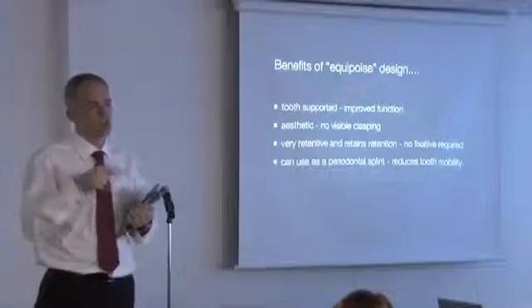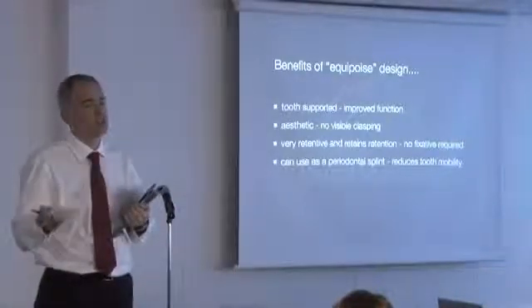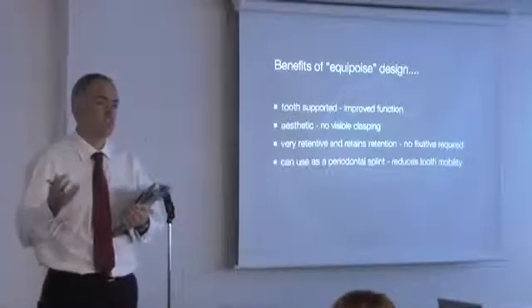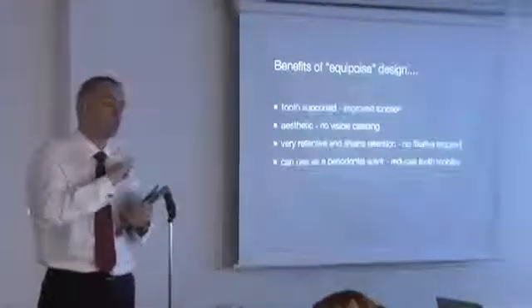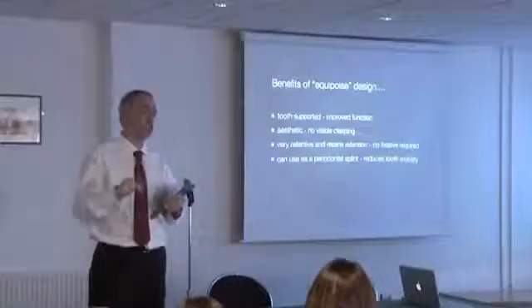Very few patients, unfortunately, are treated properly for periodontal disease. So we might send them to the hygienist every 3 months. Sadly, that's not actually treatment. It's not going to work unless they have the actual proper help to remove the disease process. But this, combined with 3-month periodontal appointments to the hygienist, might keep that dentition going for many more years. But most importantly, they've got quality of life that they would not have had with a partial denture. They can eat things they couldn't have eaten before.